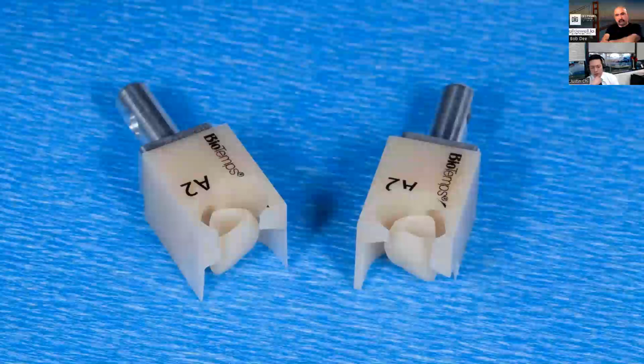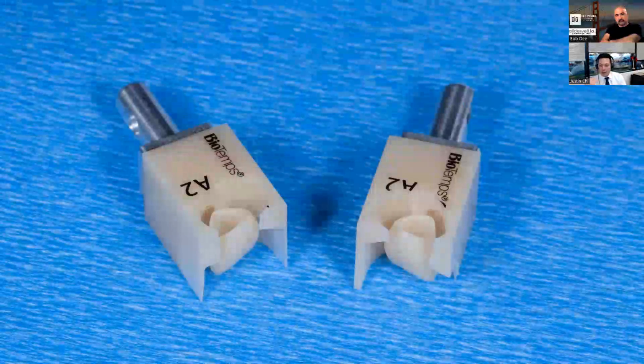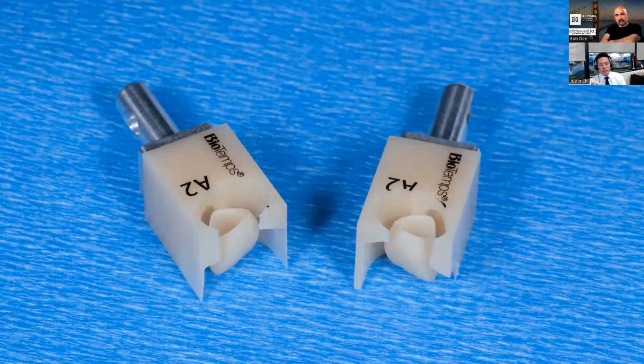You might be thinking, why would I want to make provisionals? But there could be several situations like this case here where you want to just have something fresh on the preparation, have the patient try it out, or for any aesthetic case, I do love using this process. Evaluate the aesthetics, have the patient test drive the aesthetics, especially if I'm doing crown lengthening, allow the soft tissue to heal. You basically get a perfect fitting provisional in this PMMA material that mills out in 5 to 10 minutes, real easy for your patients.